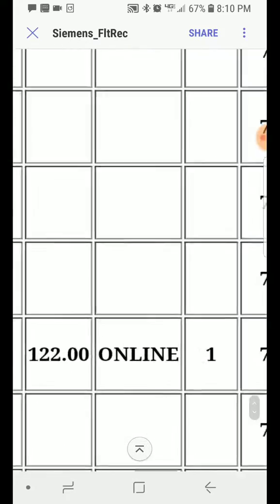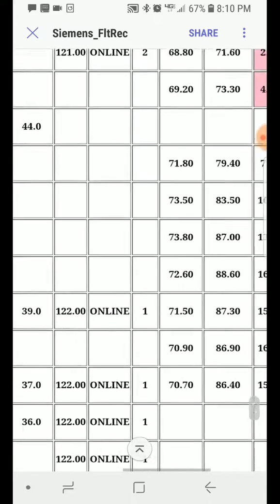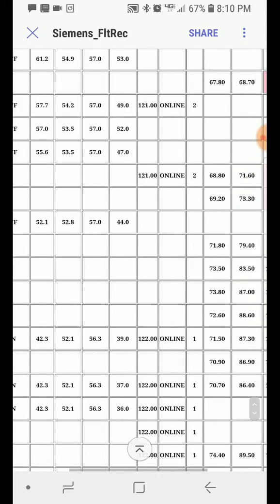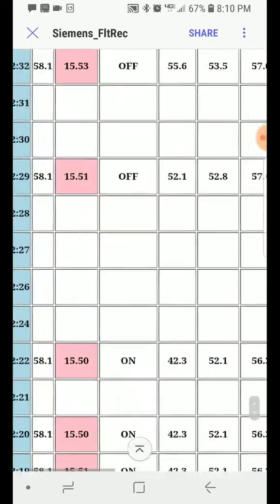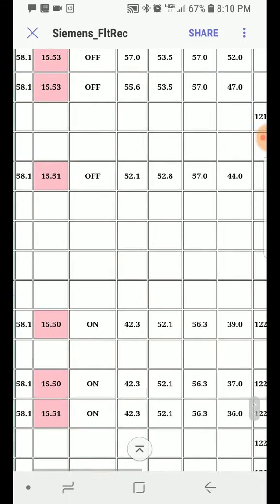When it's on battery, right now it's online, but when it's on battery, it'll show on battery. When it's shutting down, it'll say it's shutting down. When it loses power altogether, it'll show you there. That's the amount of volts. Now this is all the magnet information coming from the MSUP. So you get blank readings when you're in the middle of scanning, or when 480 power is off.